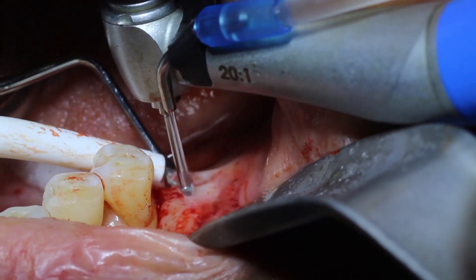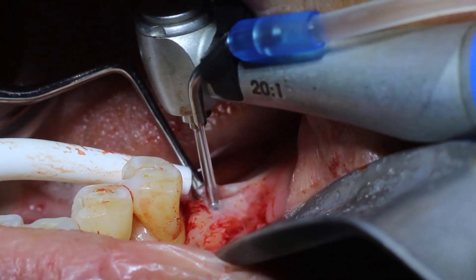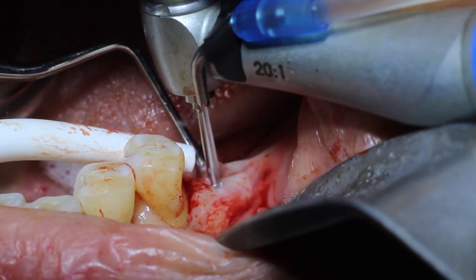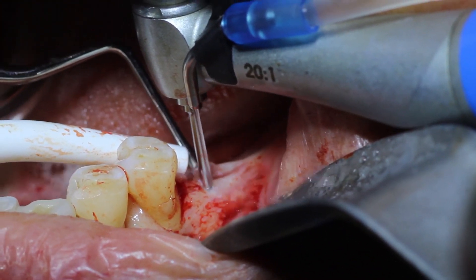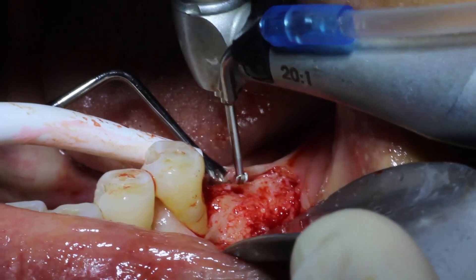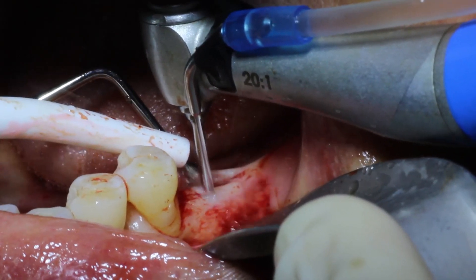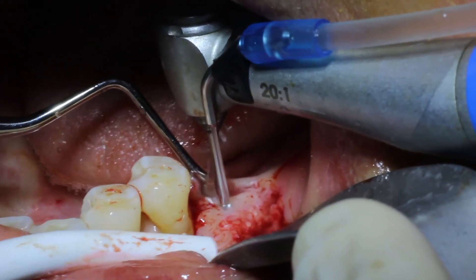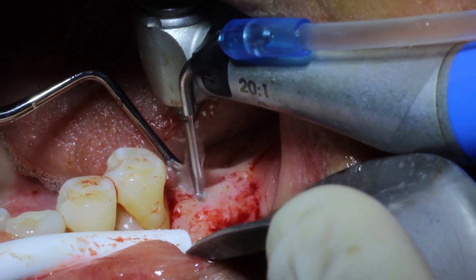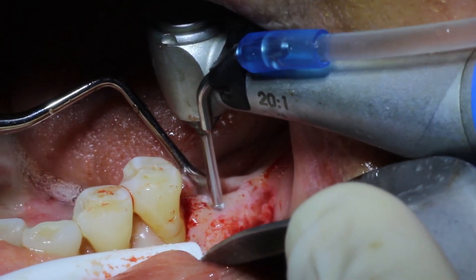I reflect the lingual and I reflect the buccal — it's really important to have your assistant reflect the lingual portion. You're going to go to the middle of the ridge and take it to about the depth of the burr. If you want to go deeper than that it's better to jump up to your regular pilot drill. Using this round burr is much easier than trying to use the sharp edge of your regular pilot drill, because that'll just bounce around rather than give you a firm seat.